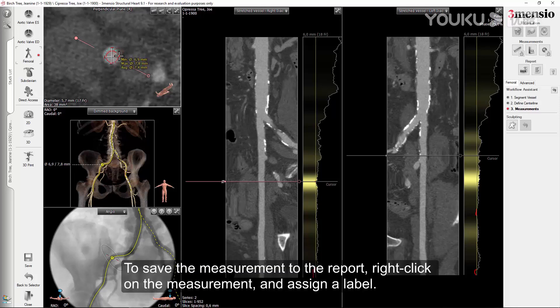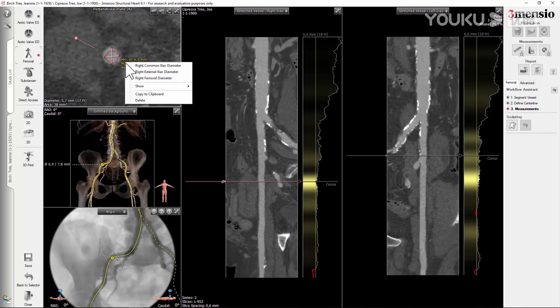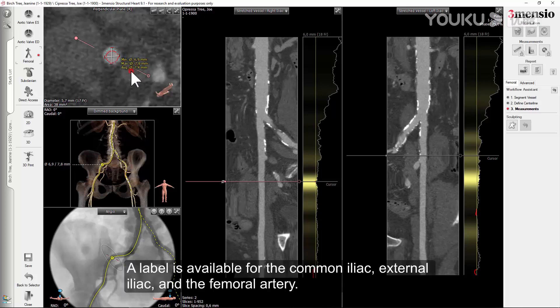To save the measurement to the report, right-click on the measurement and assign a label. The label is available for the common iliac, external iliac, and the femoral artery.